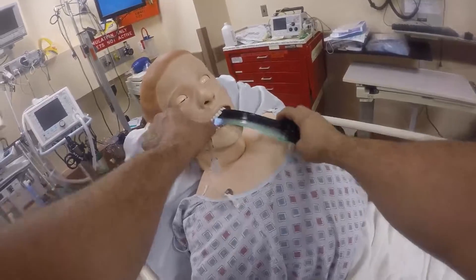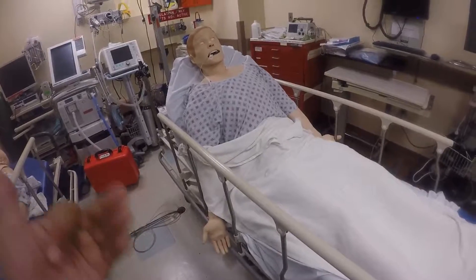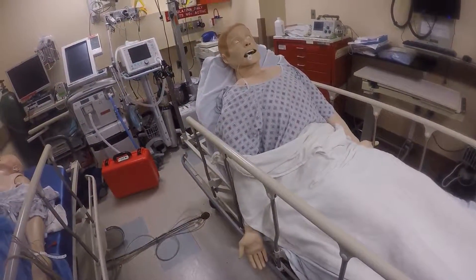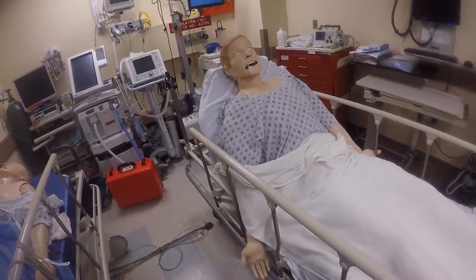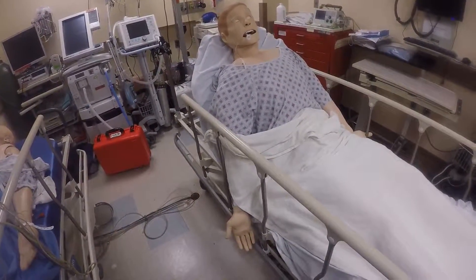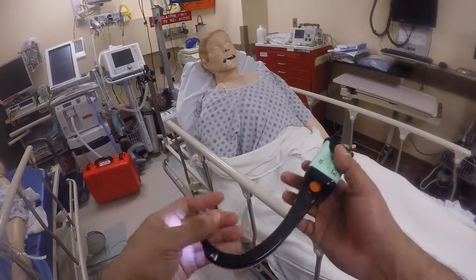Peel it to the side and you're in. This just adds to your arsenal of ways to intubate a patient without having to use the traditional sniffing position or ramping position of RSI. The Tomahawk method has its reasons, and there's a time and place for it — it's possible with the Airtraq.